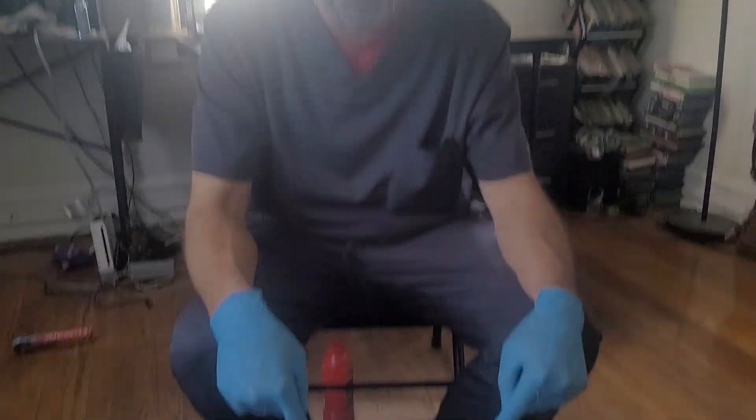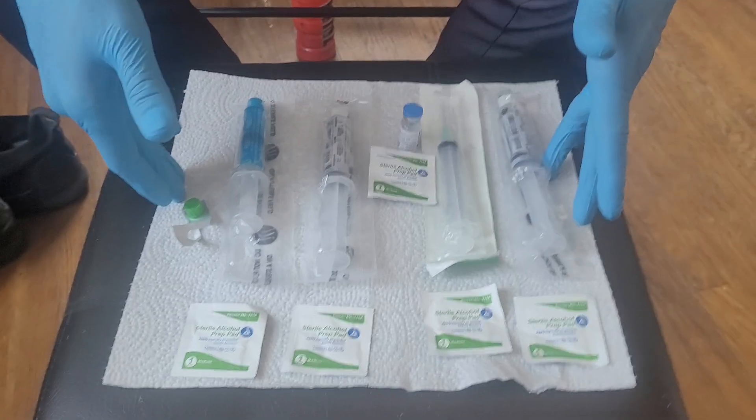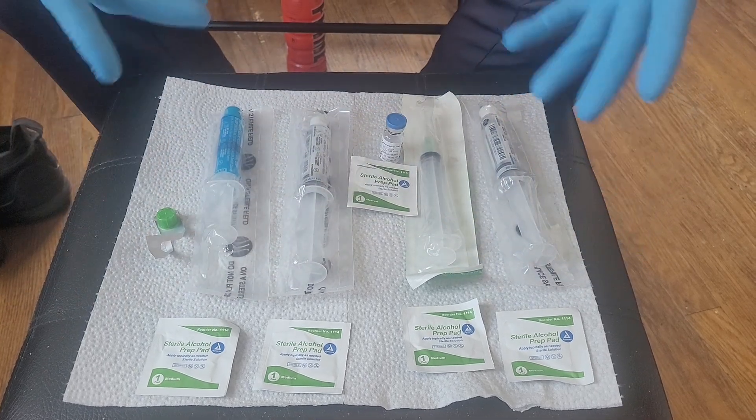Vampire RN here with a quick lesson today, just going to show you how to prepare a slow IV push of really any type of medication. The goal is to show you how to draw the medicine up. We're working on a fresh surface — a new paper towel — I cleaned my hands, put gloves on my clean hands, and now we will prep everything.